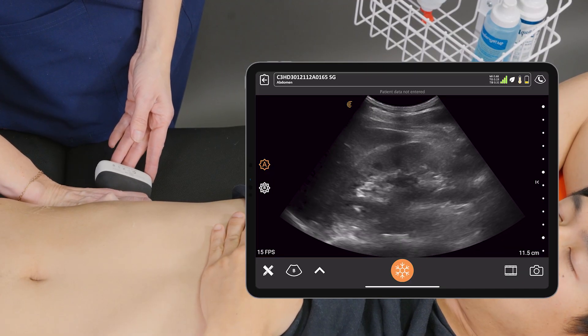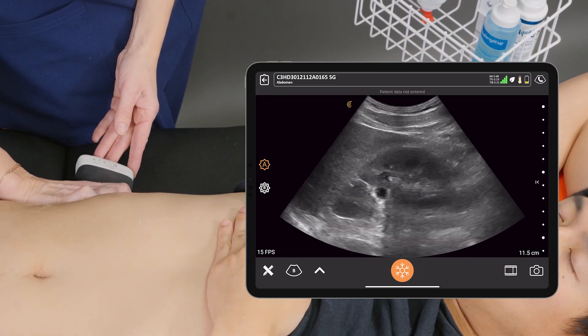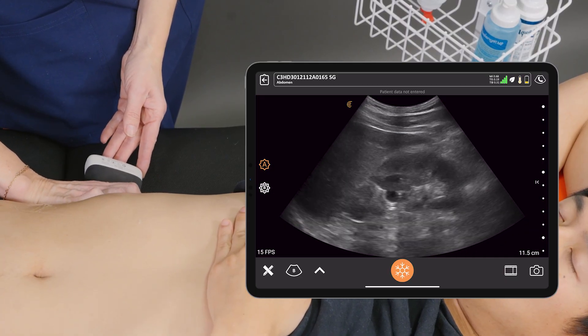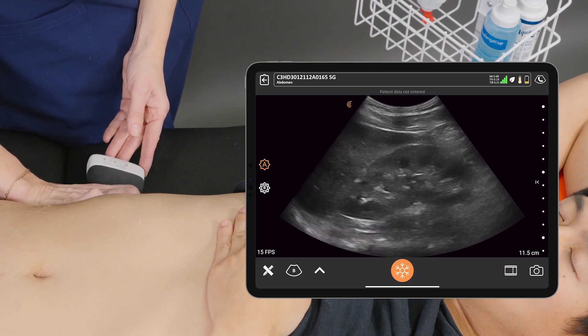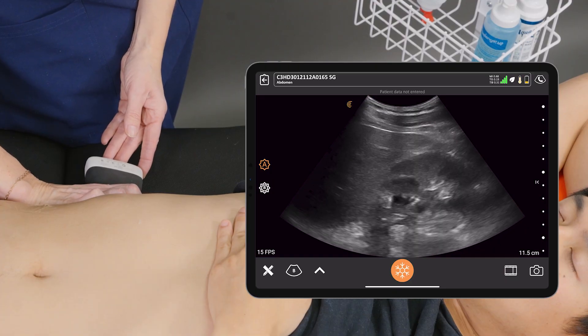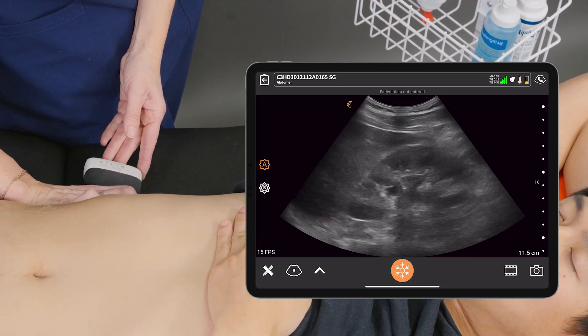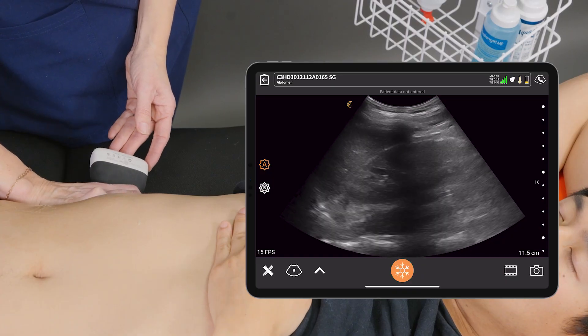I'm going to ask my patient to take a deep breath in, and this brings the kidney down below the diaphragm and gives us a more clear image. We're going to scan all the way anteriorly and all the way posterior in the sagittal orientation. And breathe.